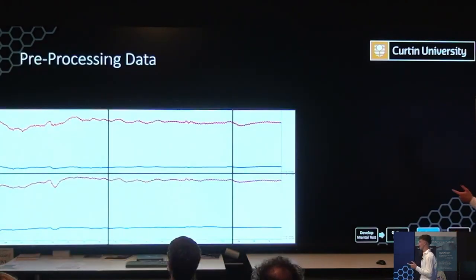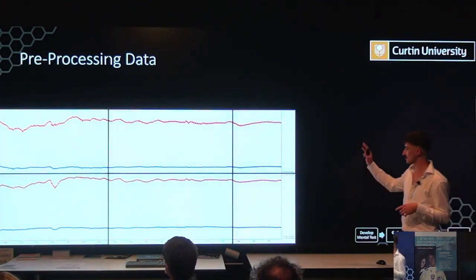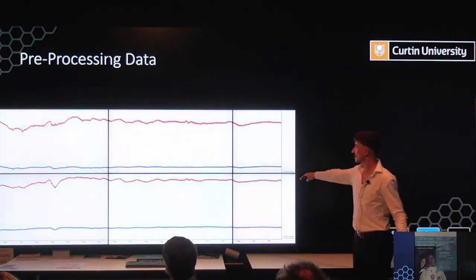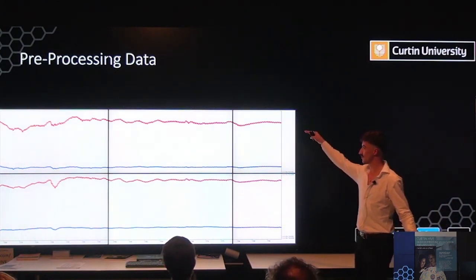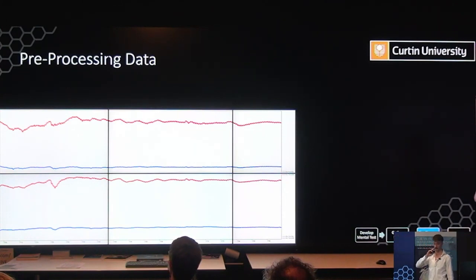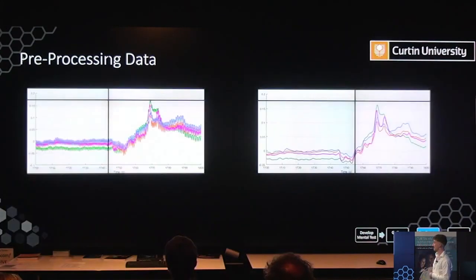So what I've got here for you is just a small snippet of a signal. And in the red trace, we can actually see this oscillation up and down, and that's the presence of a heartbeat. Although this itself does tell us one useful bit of information, that my subject was in fact alive during the test, which is good.